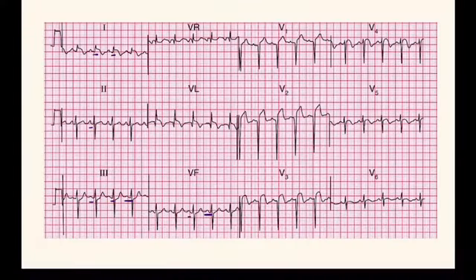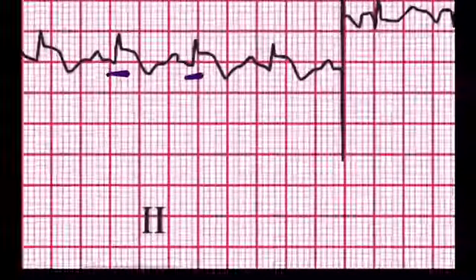We know that this ECG is of a myocardial infarction patient, but we don't know the location of the infarction. So what we will be looking for is the Q wave first. In which lead can you see the Q wave most prominently? Let's start with the first.